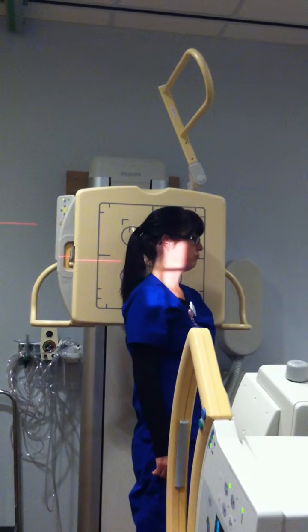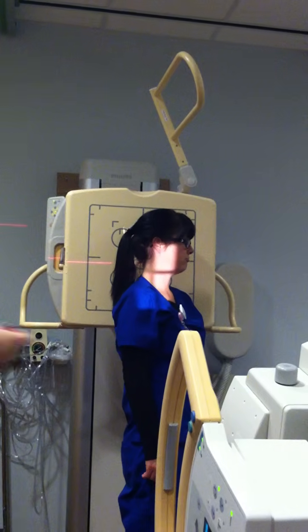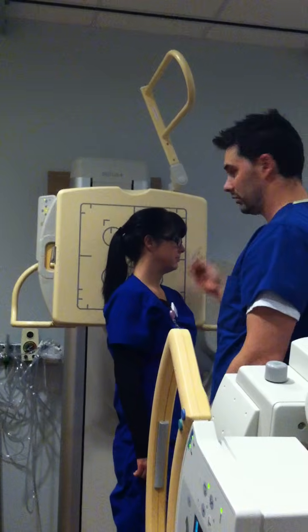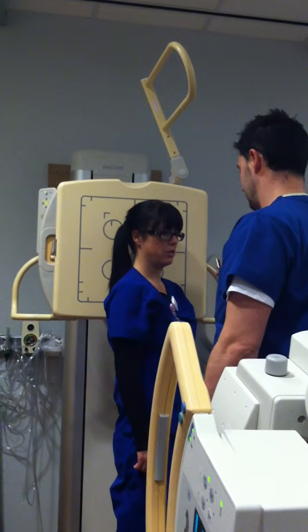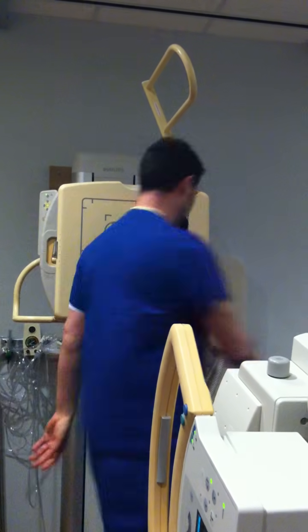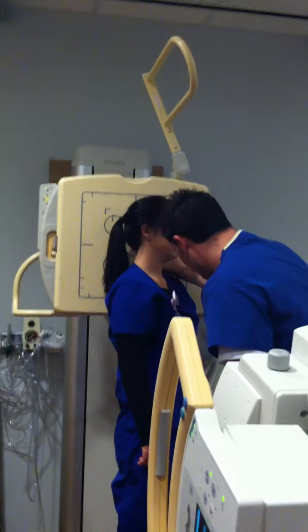Okay, where would your marker go on this? What do we always like to mark, side up or side down? Side down. Which one do you have? Left. Side down, so we put it in the front. Yep. Put the left marker on the left side. Very nice.